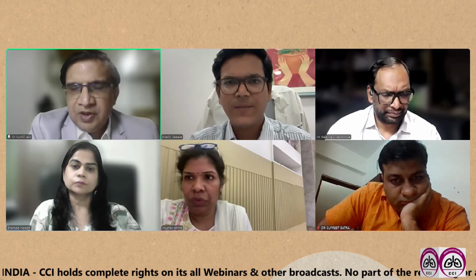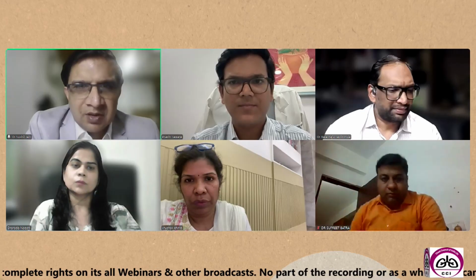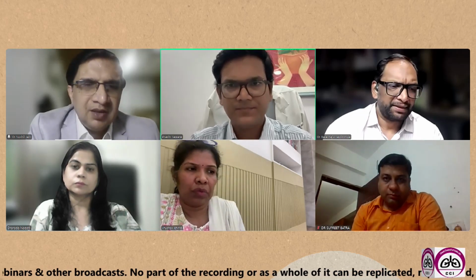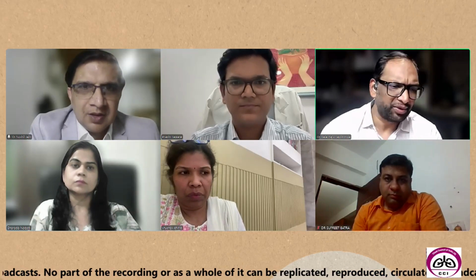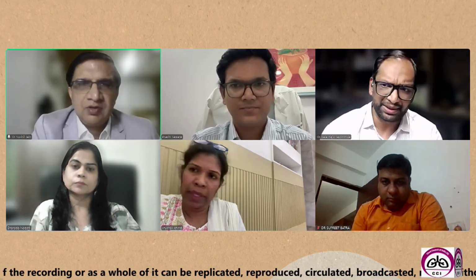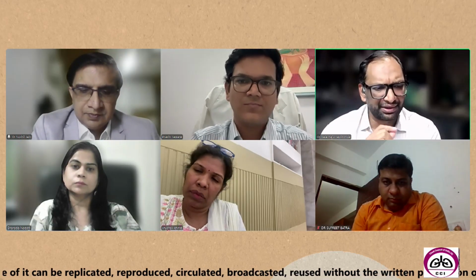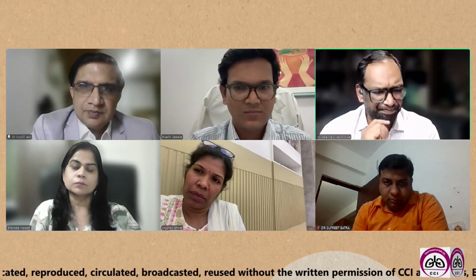What is your opinion, Dr. Bala? I hardly require paralytic agents in my practice. We always do it in conscious sedation. Very, very uncommon to convert to GA. Very, very uncommon for paralysis. So I think most of the time we are able to do it with a deeper conscious sedation. In fact, I don't use any iGel or endotracheal tube. We also don't do it. I only do it under deep sedation with a nasopharyngeal airway. I found that keeping a nasopharyngeal airway in place gives better control over ventilation than just giving oxygen.